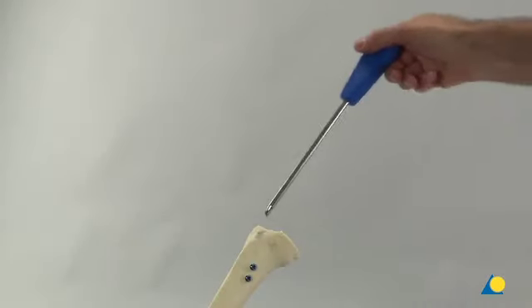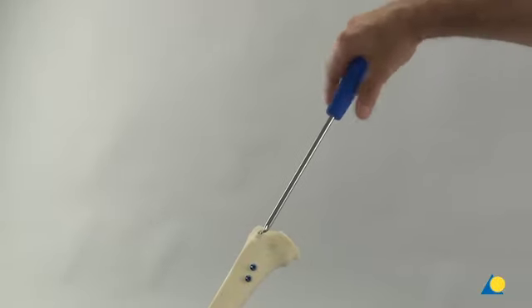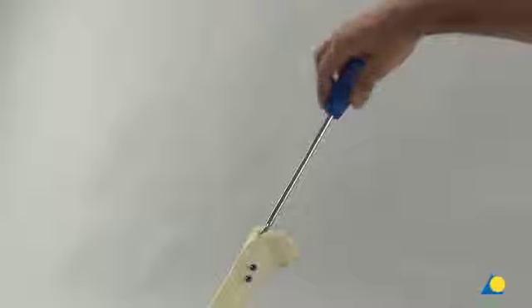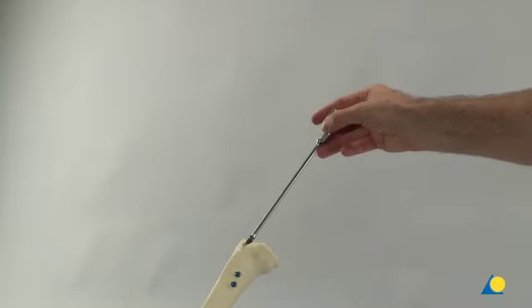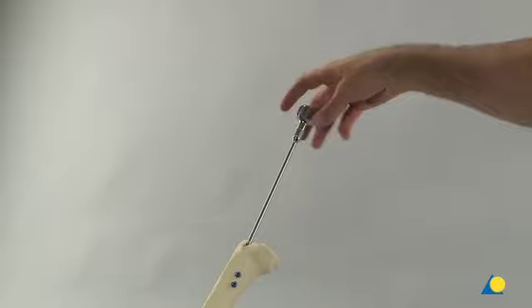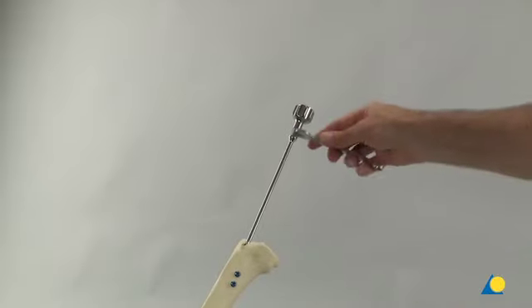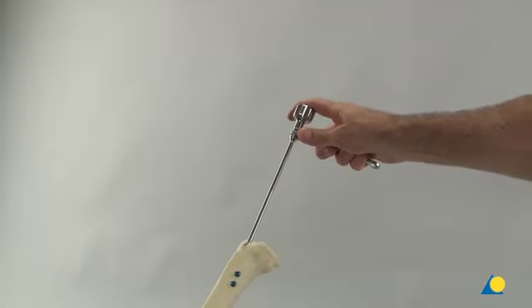The T40 star drive screwdriver is threaded into the end cap, and the end cap is removed with counterclockwise turns. To prevent rotation of the nail or displacement posteriorly, the extraction screw is threaded into the nail and tightened with the combination wrench prior to the removal of the locking screws.